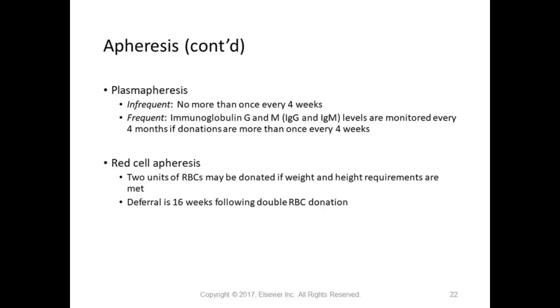They'll put that patient drawing with blood on a different type of machine to split the unit. So in your blood bank inventory, you may come across 2 units with the same donor number, and this is why. They're now making double reds. So when we do have that in our facility, if we see 2 units and a person needs 2 units, we just try to give those 2 units to one particular patient. Does it matter? No. But it helps with record keeping and things like that.